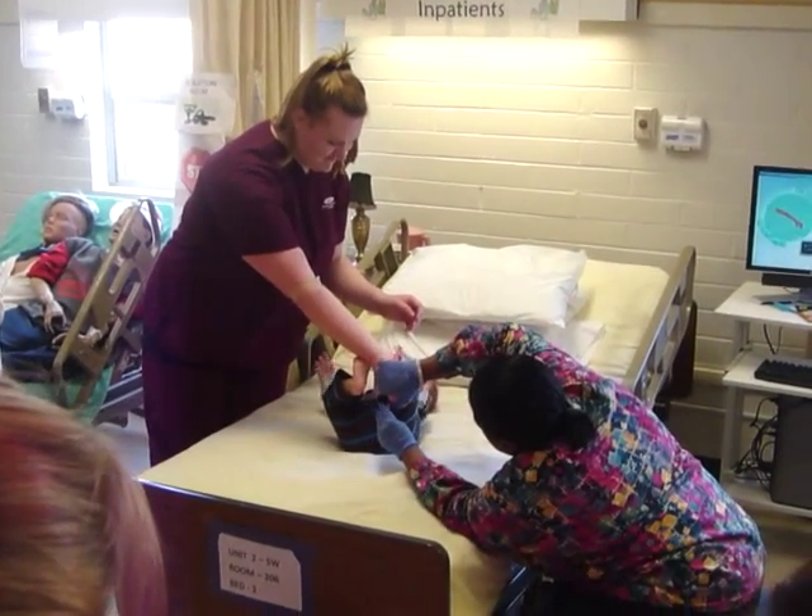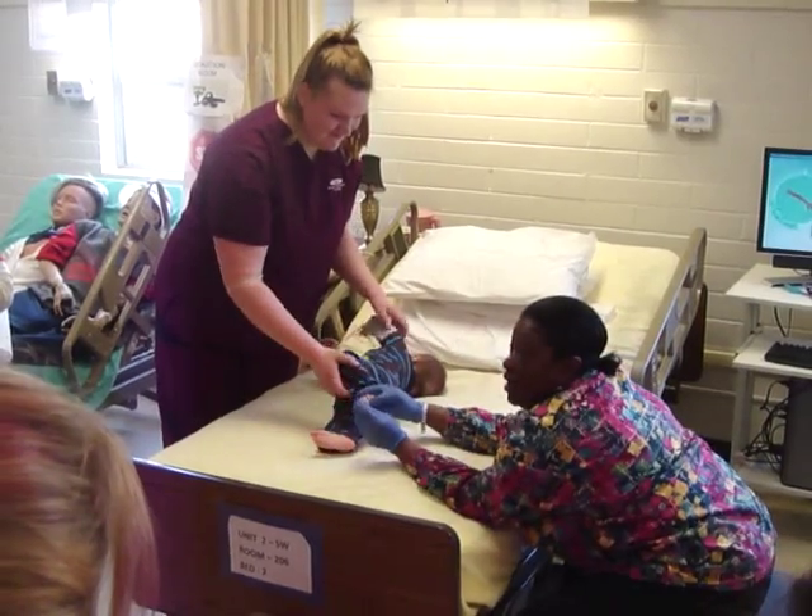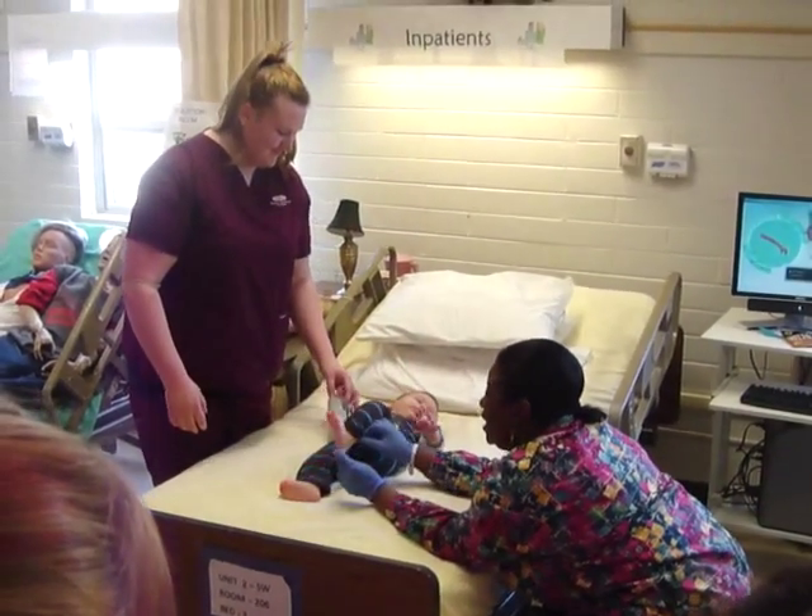Squeeze, squeeze, squeeze — almost done. He hasn't even cried or anything.